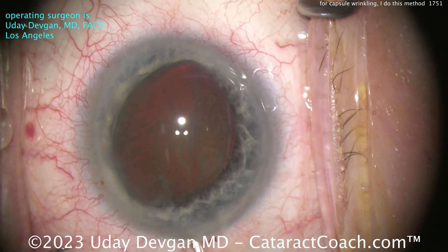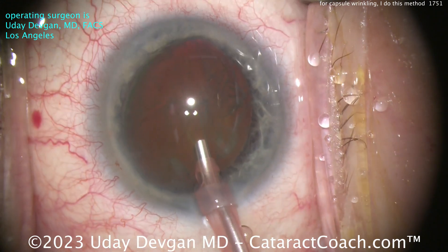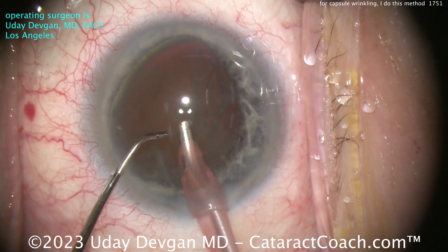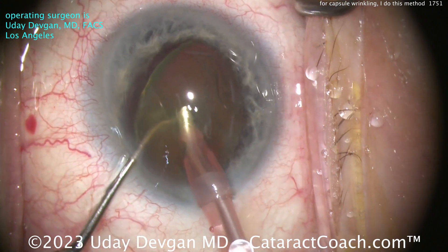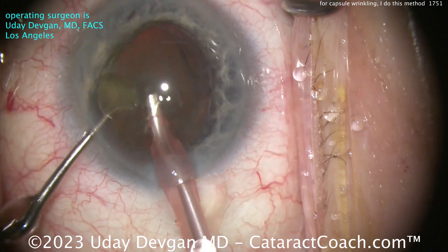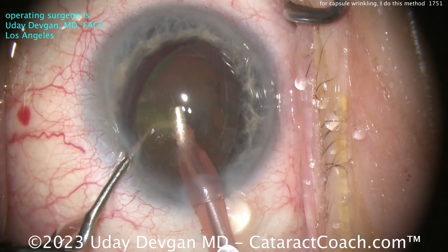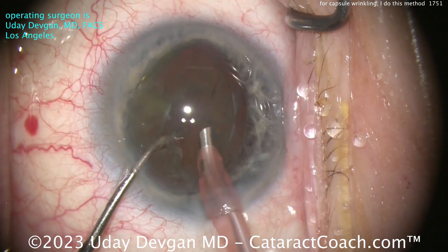Here comes the phaco probe. I want to do a chop right off the bat. Probe inside the eye, got our small pink sleeve — the 2.2 sleeve — going in with the probe right in the middle. Chop, going around the equator to break this in two halves. Didn't quite get it — that's okay. We'll aspirate a little more of the nucleus, try to get it moved around. There's a little bit of a shallow anterior chamber too, so I don't want to be too much in the AC, more iris plane.